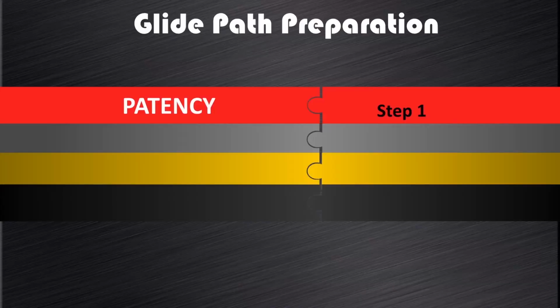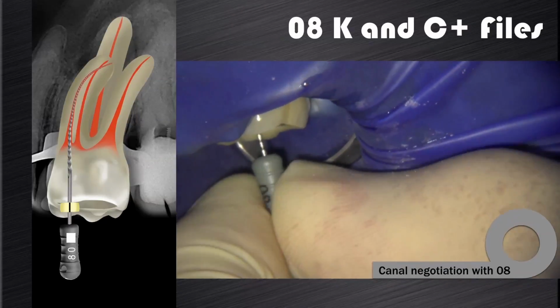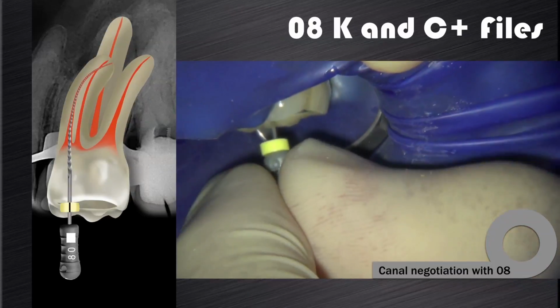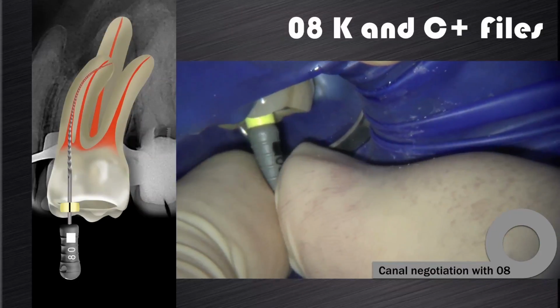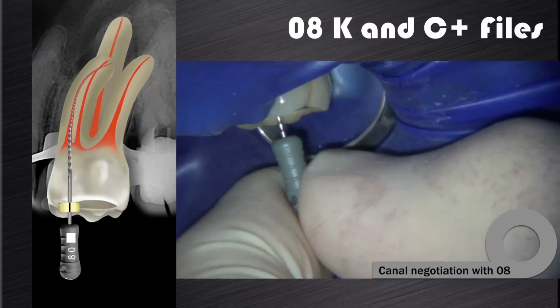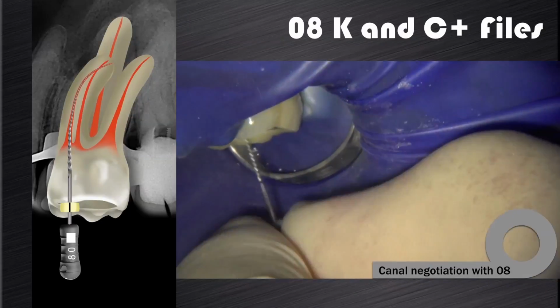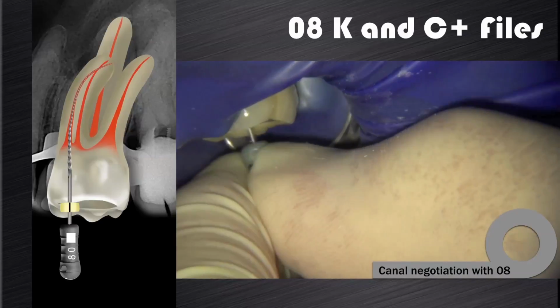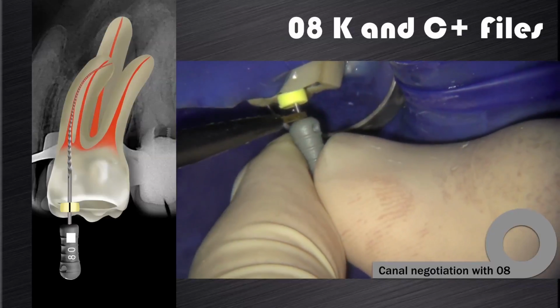As mentioned before, canal patency is the first step. I use a combination of 08C+ and 08K files to negotiate the canals to patency. Some cases are easy and some cases are very difficult. I think that the inability to create patency to full working length is often the reason why we see so many poorly prepared and obturated root canal systems. On this video clip you can see that I've just achieved patency now. After that I will do my working length using an electronic apex locator.